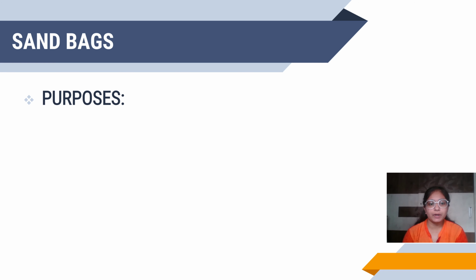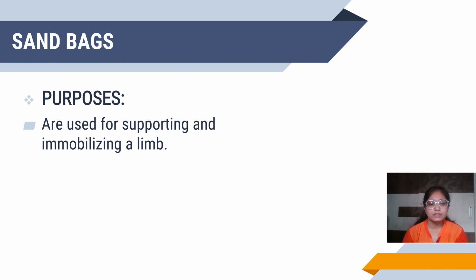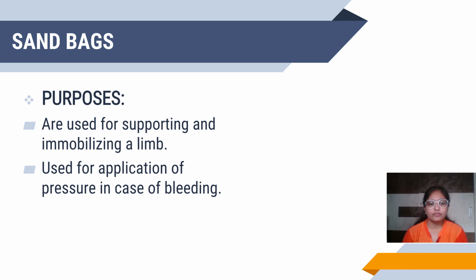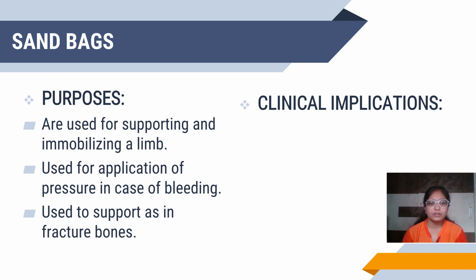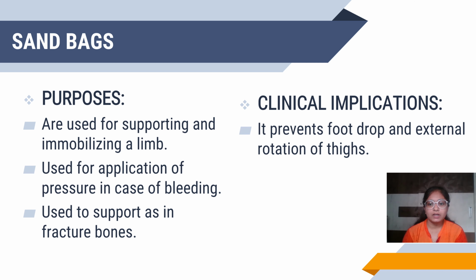Now what are its purposes? Sandbags are used for supporting and immobilizing a limb, for application of pressure in case of any bleeding, and for supporting fractured bones. What are the clinical implications of sandbags? It helps to prevent foot drop and external rotation of the thighs.